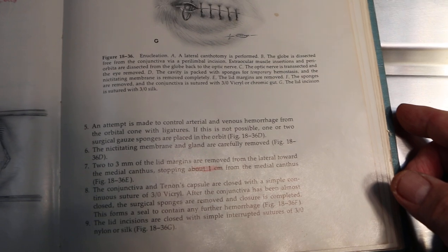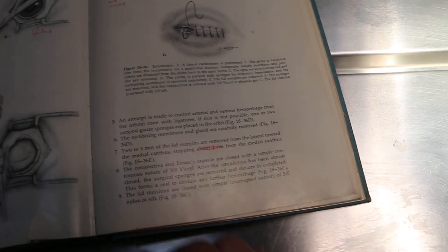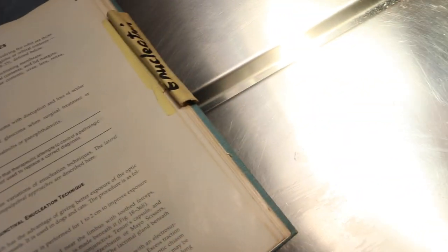I'm showing the text here so that any student who wants to refer to this procedure can see it. The procedure is called the lateral subconjunctival enucleation technique. That is the name of this surgical procedure. Now let's look at the final results.